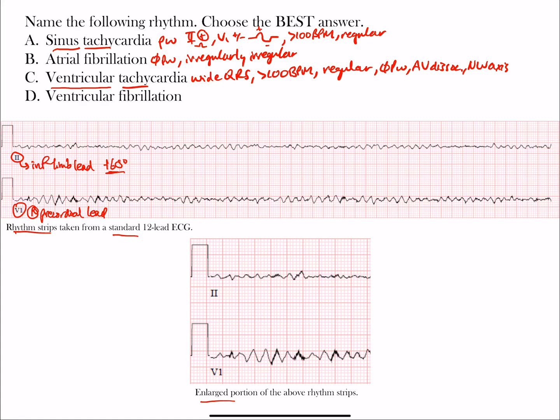Other features of ventricular tachycardia include a northwest axis, fusion beats, and other findings we won't get into here since we only have two rhythm strips. When differentiating between V-tach — a wide complex tachyarrhythmia — versus a supraventricular arrhythmia with aberrancy, that can be very difficult. Moving on to ventricular fibrillation: the ventricles are essentially fibrillating, so you have no clear complexes.